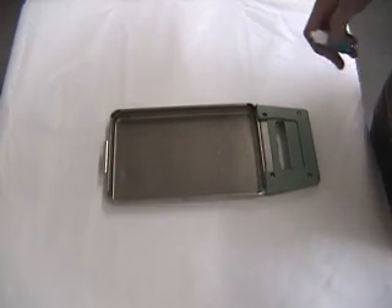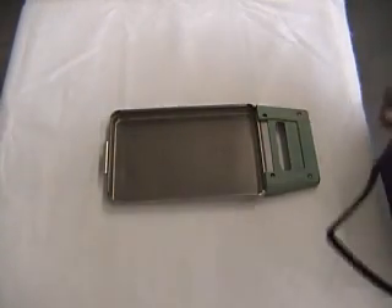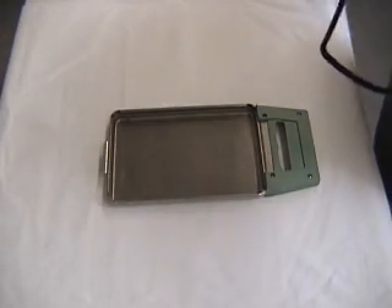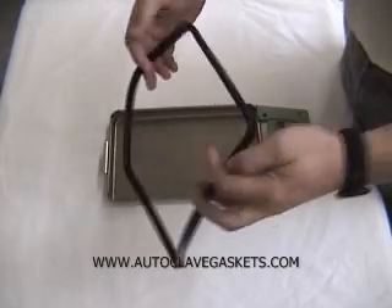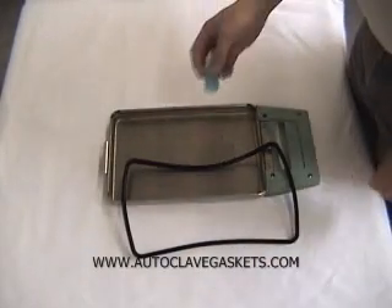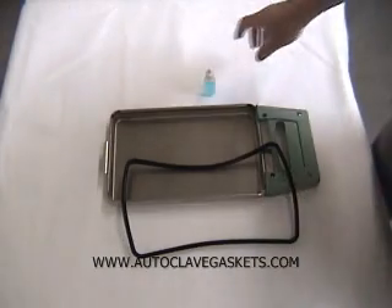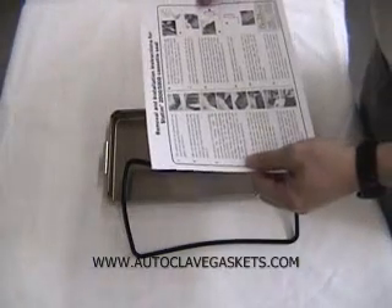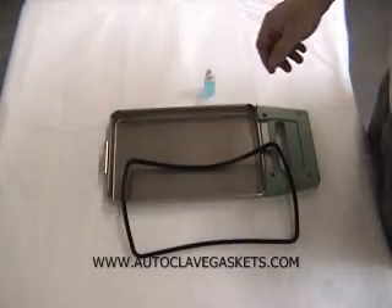Now we're going to put our new gasket in. We're going to use the Statum 2000 gasket kit. That includes the replacement gasket itself, a bottle of lubricant to help you install the gasket, and of course instructions on removal and installation of the new seal.